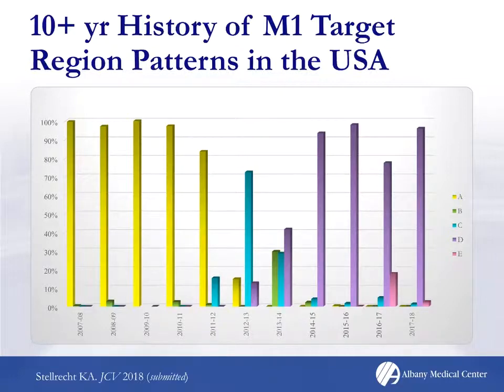And whether it's significant or not, I can just tell you that Marie Landry at Yale has been using the CDC protocol for years, and she has had more recent problems with detecting H3N2s. So it could possibly be a significant mutation for the performance of assays. But luckily that pattern has also been disappearing.